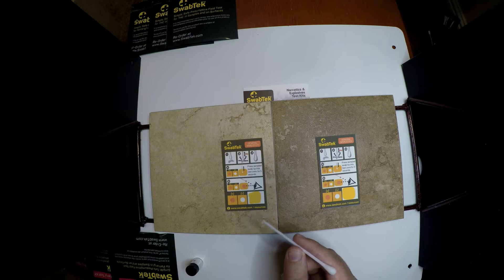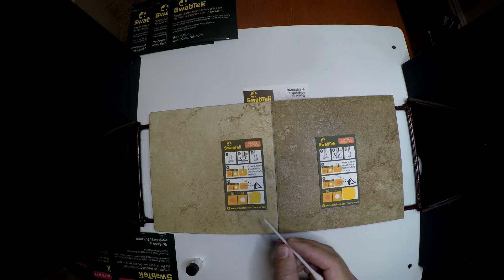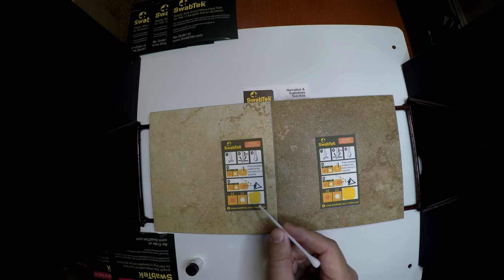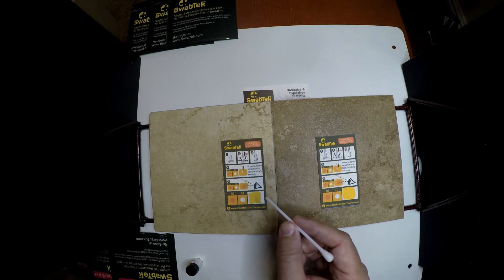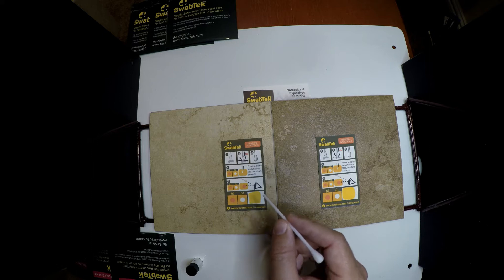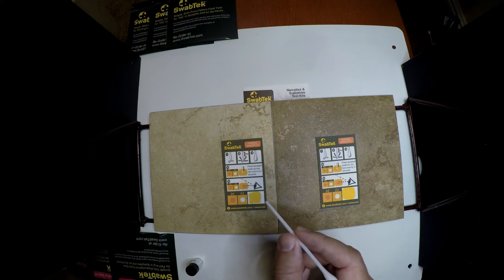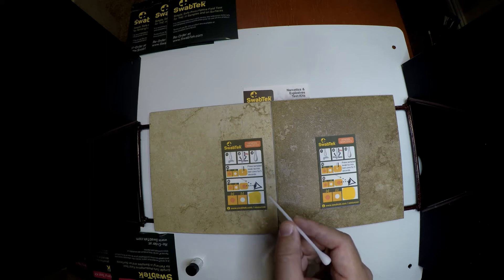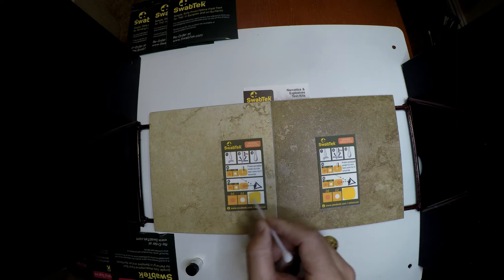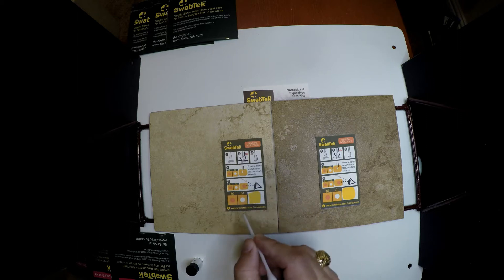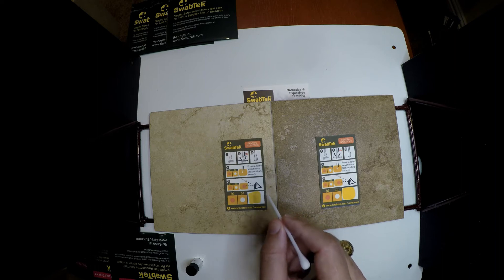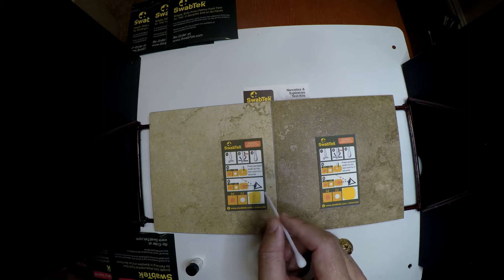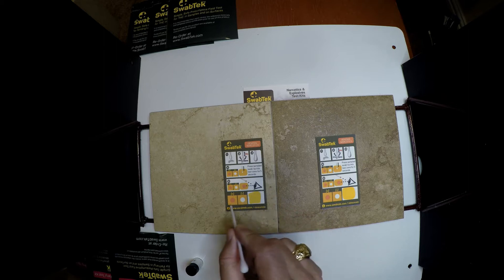This is the SwabTech General Narcotics Test Kit. This test kit tests for synthetic cannabinoids like K2 and Spice, it tests for fentanyl, it tests for cocaine and amphetamines and heroin, all in a single test. For the corrections market, this test is ideal for finding narcotics that are embedded inside paper.